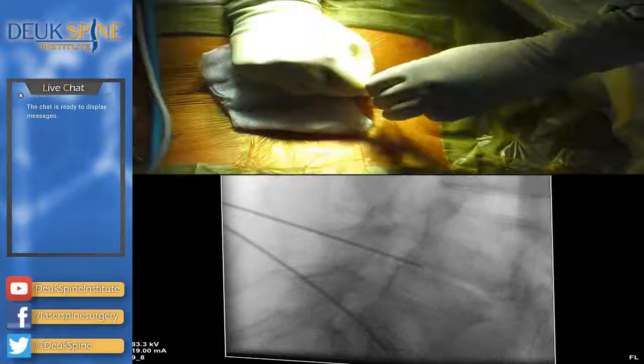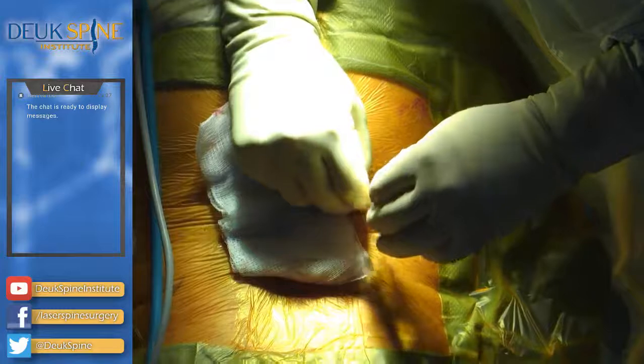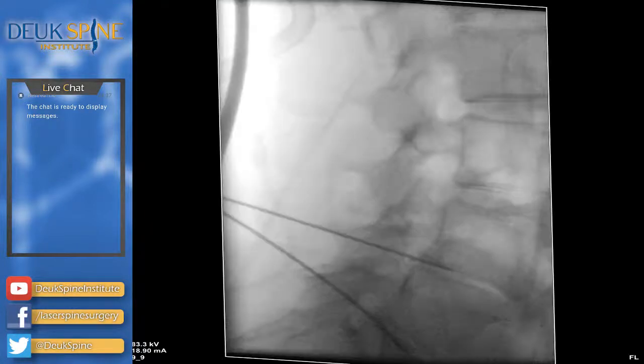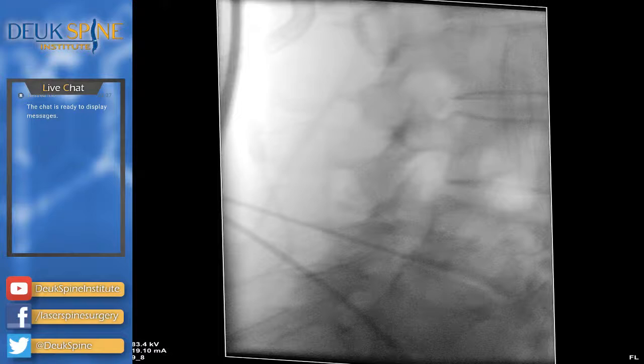It's actually moving, believe it or not. When she relaxes, you can feel it moving. All right. I'm just curious how much progress we made. How bad is that on a scale of 1 to 10? 8. It's just leaking out. The disc is totally incompetent.